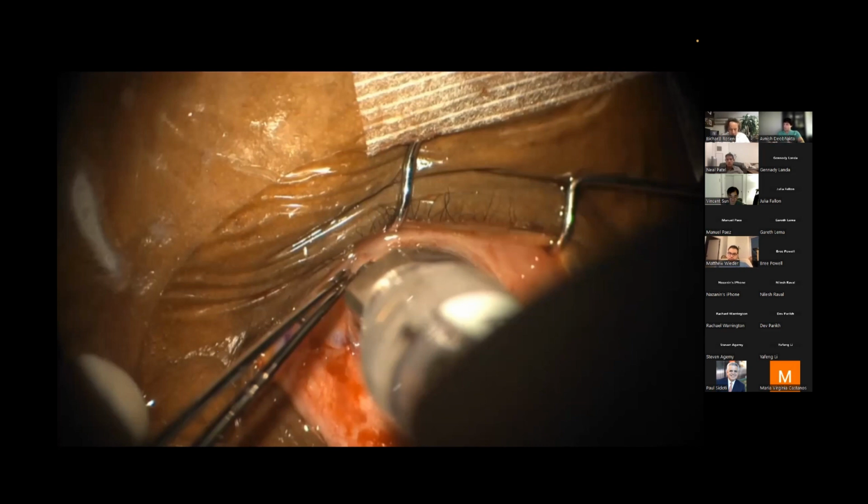I agree 100% with Viscoat, and again, it goes away like 3-4 days after from the anterior chamber, so you can leave it. It's not a big deal, and the pressure can have a little bit of a spike, but you can control it. And also our glaucoma colleagues do it all the time. They inject Viscoat and nothing happens, so it's not that dangerous to leave a phakic patient with Viscoat inside the eye.